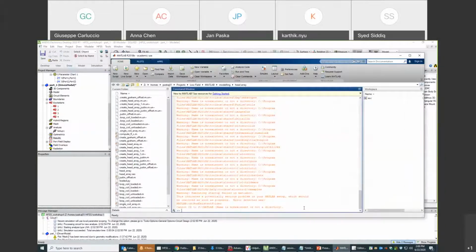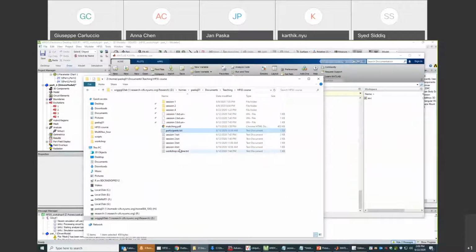And then in MATLAB, for example, we can import it. No, I'm gonna just open the text file. It's easier. Sorry about that. I would have to look up for 5 minutes how to import it.